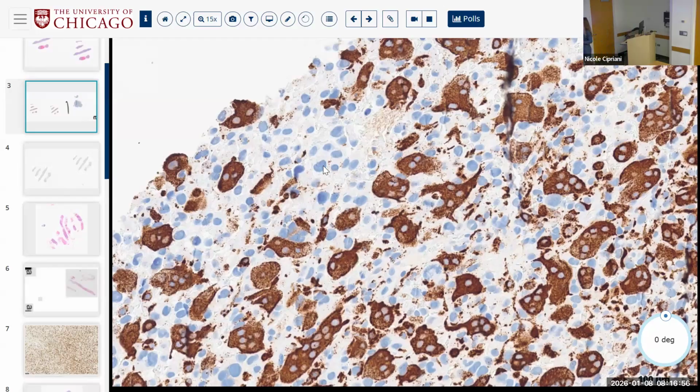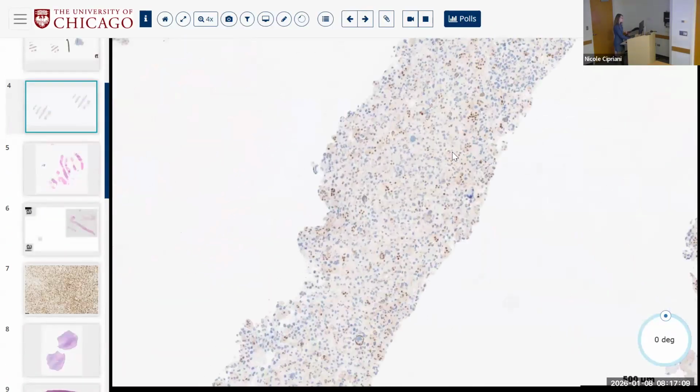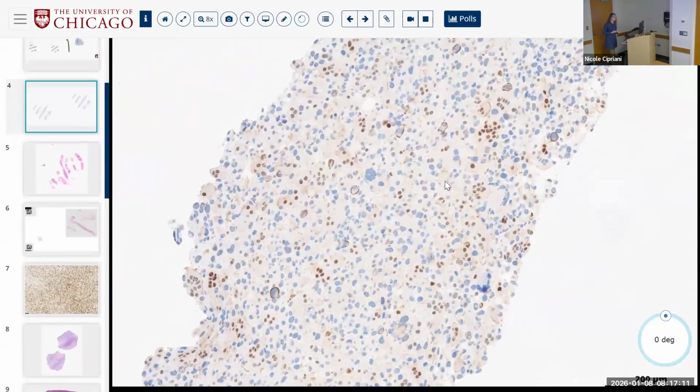One, non-neoplastic bystanders, two, neoplastic mononuclear cells. So I think this is CD68. The other pitfall with giant cell tumors, or giant cell rich tumors, right? Especially if you are in a deep soft tissue site, and we're going to go back to James's original differential diagnosis, right, of an adipocytic tumor with maybe some kind of heterologous differentiation or co-opting of giant cells, right? You should always try to exclude a dedifferentiated liposarcoma because that's easy with MDM2.